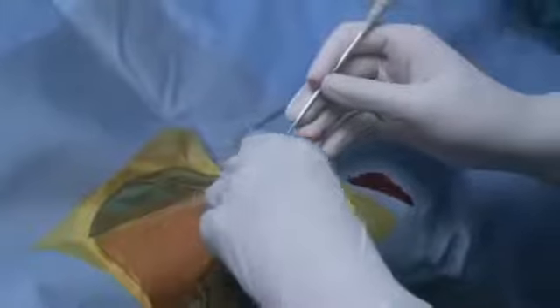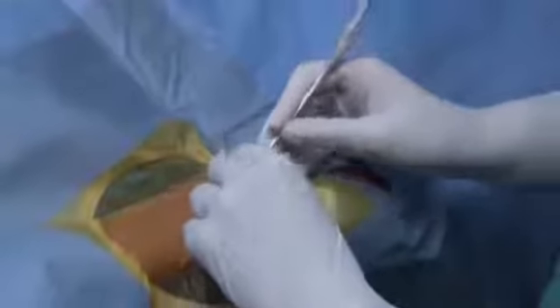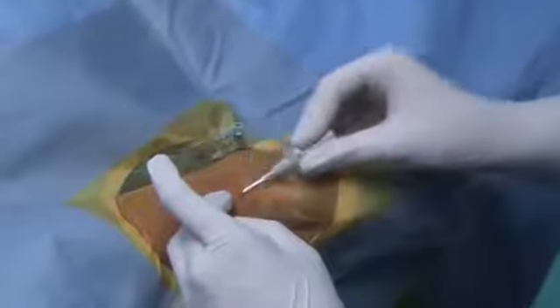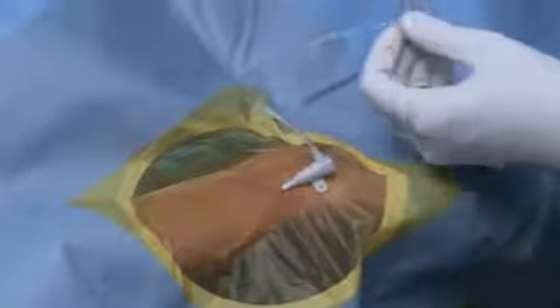Please note that most of the time you will not need a scalpel to puncture the skin — it is being introduced so smoothly. The puncture is done.